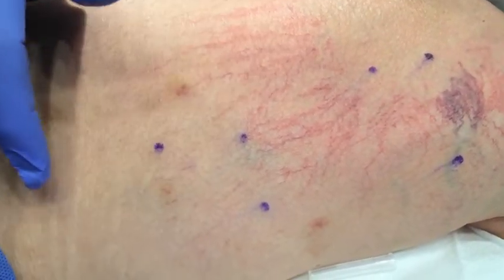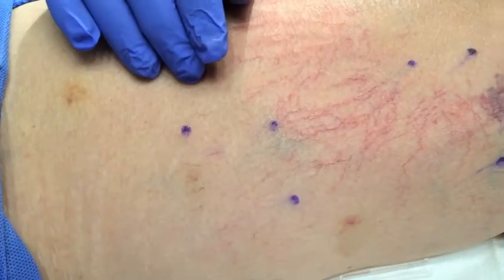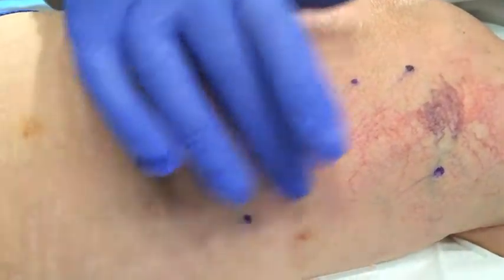Down deeper, she has a little perforator. She's had a previous stripping. She's got an incompetent branch that gives off some of these. So we're going to do ultrasound guided as well as do a little phlebectomies.